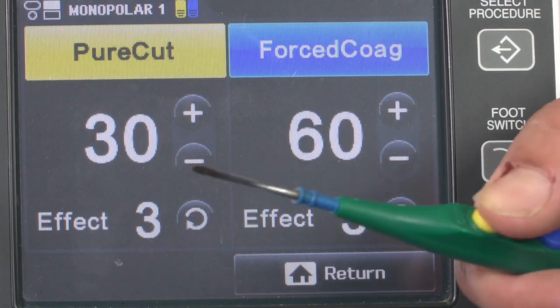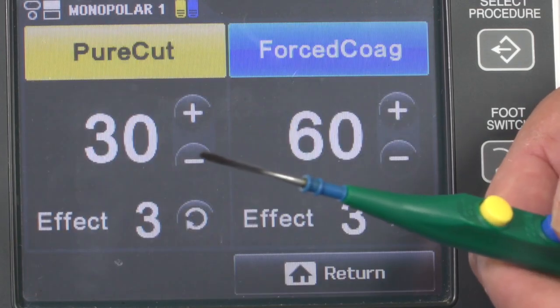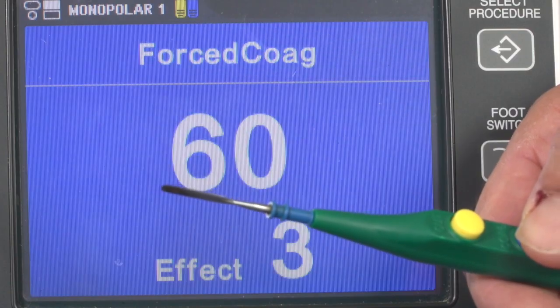Most electrosurgical instruments use manual activation. You can still assign a foot switch even though your instrument has hand activation. If you press the yellow button on the hand switch, the corresponding area on the screen lights up yellow. If you press the blue button, the corresponding area lights up blue.